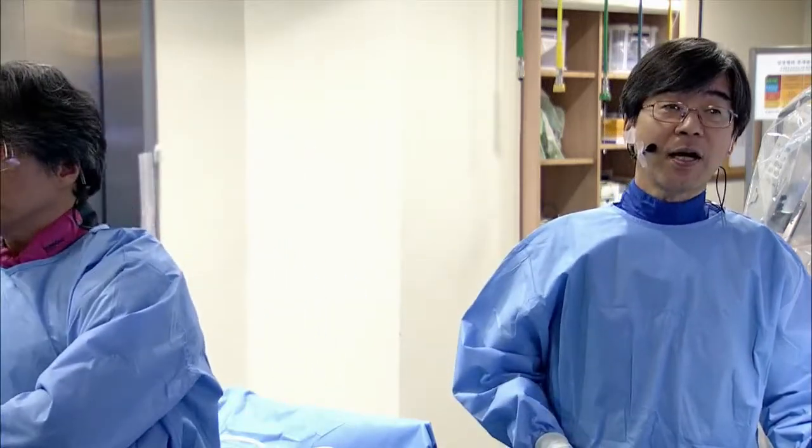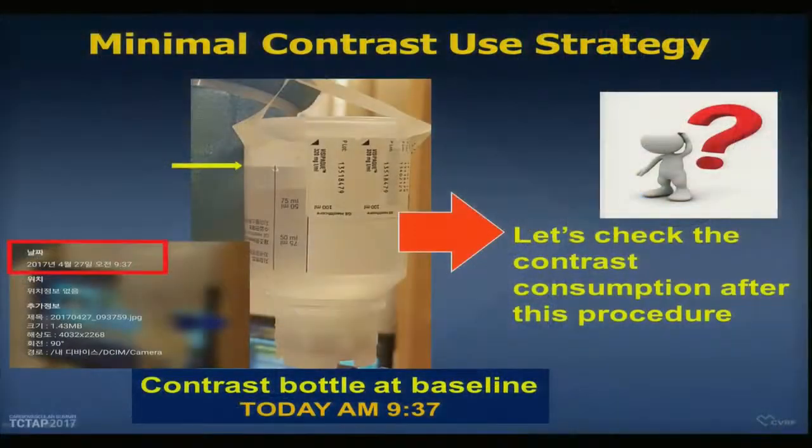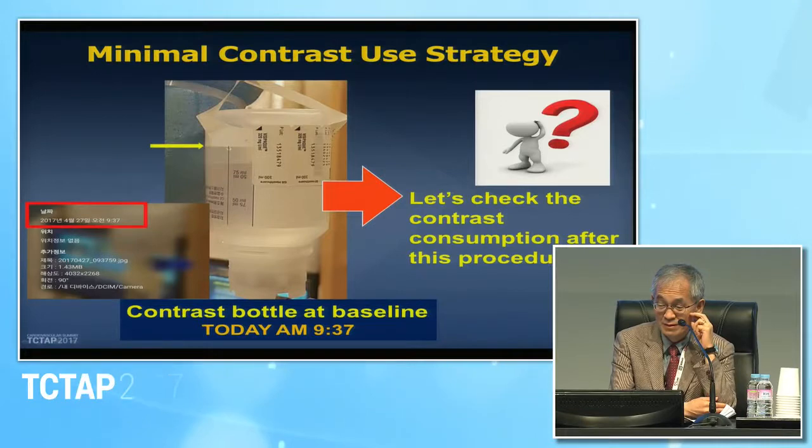Particularly, we want to fix it with a no-contrast technique, just IVUS guided, fixing the proximal LAD and left main lesion. That is our plan. Why minimal contrast? You are using a lot of contrast for OCT examination, but not in these cases. Yes, definitely. So therefore, we will use the IVUS.